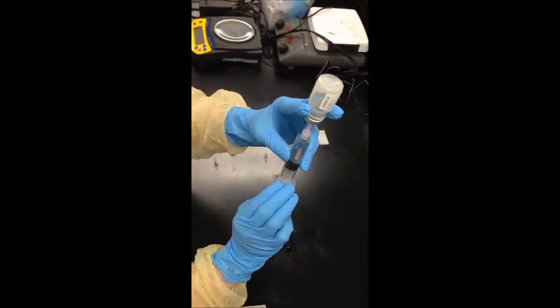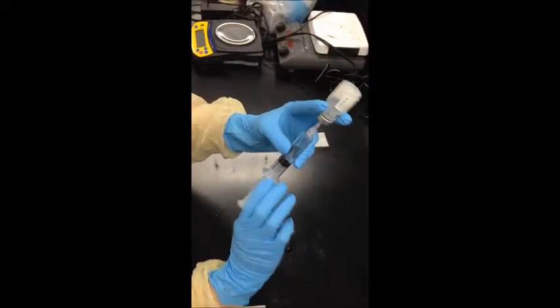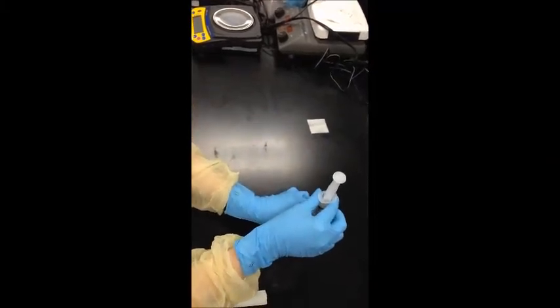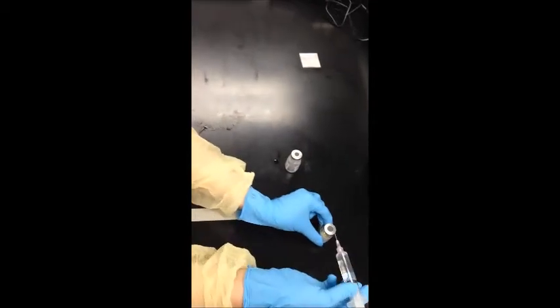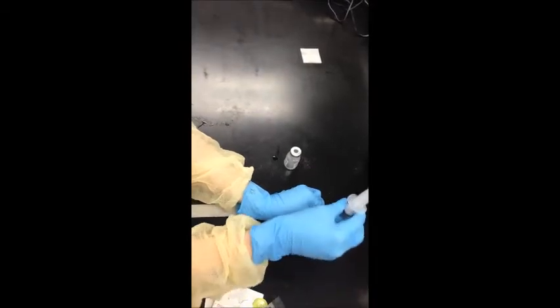Tap on the vial with the needle still in the vial to get any air bubbles out that may be present. Remove needle from diluent vial and inject the diluent into vial containing the medication in powdered form in the same fashion, with the bevel facing up initially at 45 degree angle and then at 90 degree angle, and expel diluent into the vial.